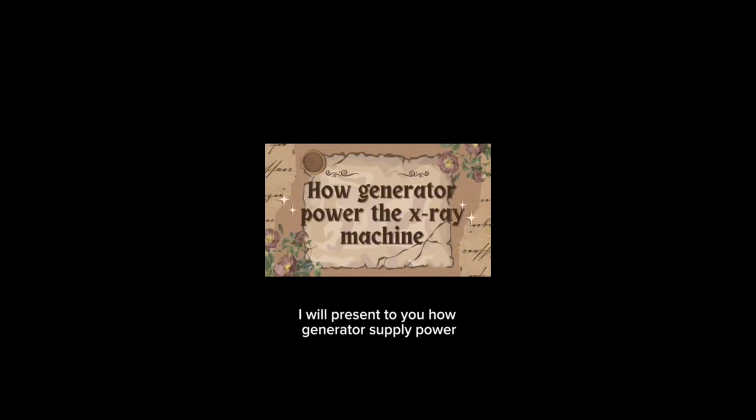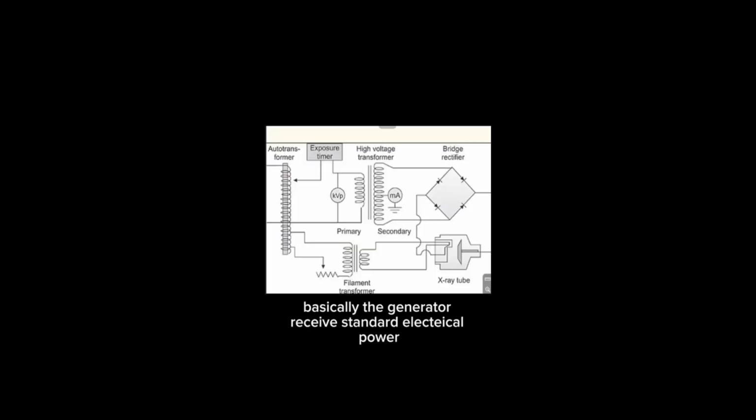Okay, next, I will present to you how generators supply power to the X-ray tube. Basically, the generator receives standard electrical power, typically 220 volts or 440 volts. From the main supply, the power is directed into the generator to begin the conversion process. The input voltage is regulated by an auto transformer, which allows the operator to adjust the voltage as needed for the desired kilovoltage. This prepares the voltage for further transformation.